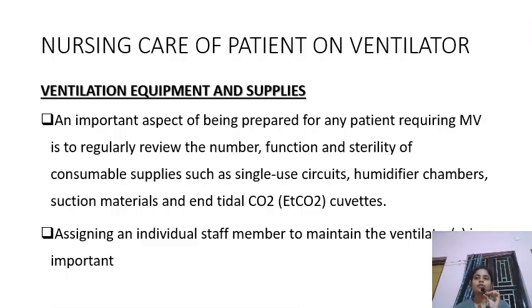If a patient is in a condition where he or she needs to be intubated emergently, the ventilation equipment and supplies, all these things should be ready. In some of the wards or ICUs, there is a separate intubation trolley in which all the intubation items that are required are kept, so that it is hassle free. If the patient needs to be intubated emergently, we have all the supplies in our hand, and there should not be any kind of delay while doing an intubation.